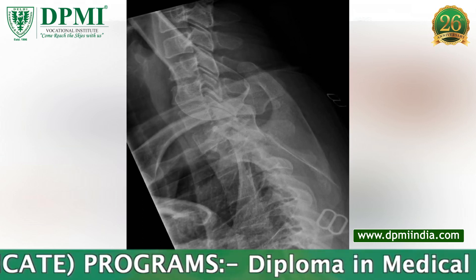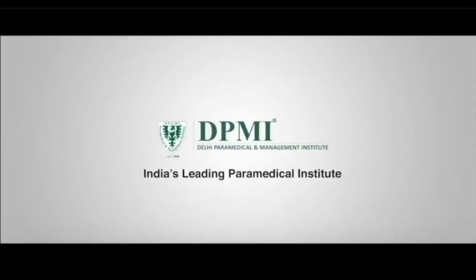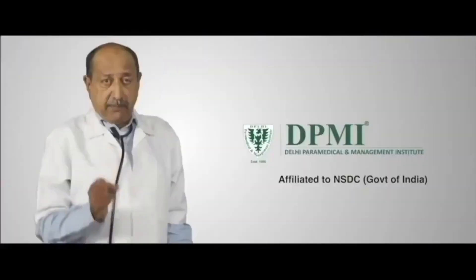Image technical evaluation: there should be clear visualization of C7 to T1, and the vertebral bodies are superimposed laterally.